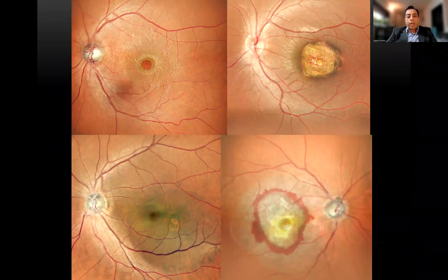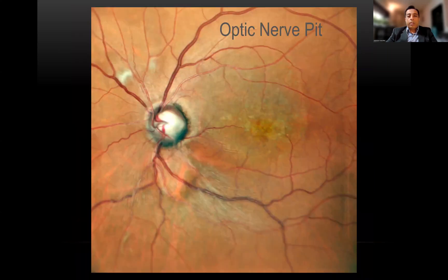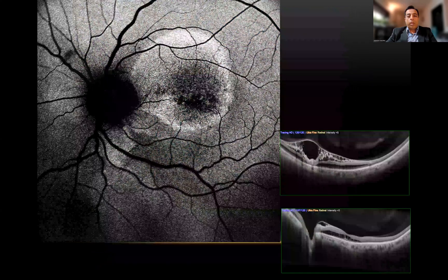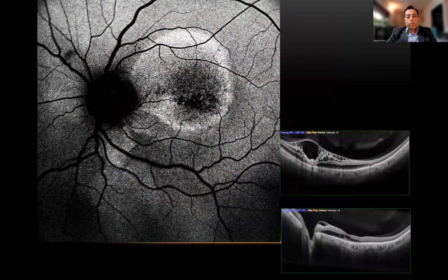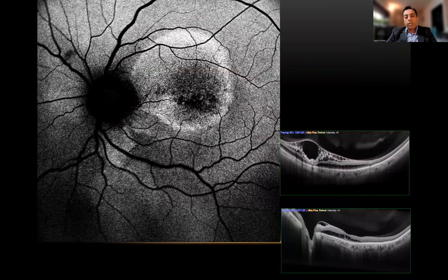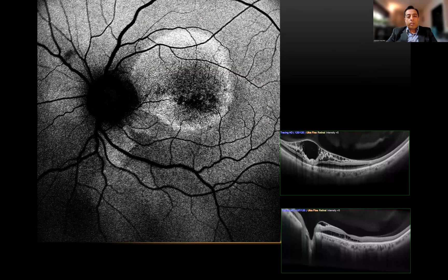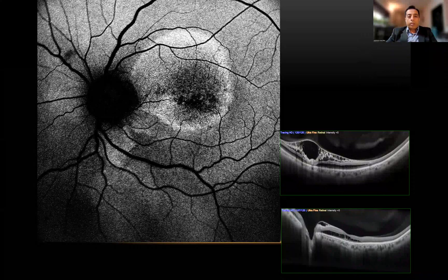Some other examples of the macular area: you see a macular hole, a scar, a subretinal membrane, a CSR, all of them depicted in fairly normal colors and resolutions. This is an optic nerve pit — you can see the pit, the disc, as well as the elevation from the papillomacular bundle towards the macula. When you do a long OCT scan of 16 mm, you can see from the disc nasally as well as towards the whole temporal part how the elevation with the optic nerve pit and the central serous maculopathy along with it is present.